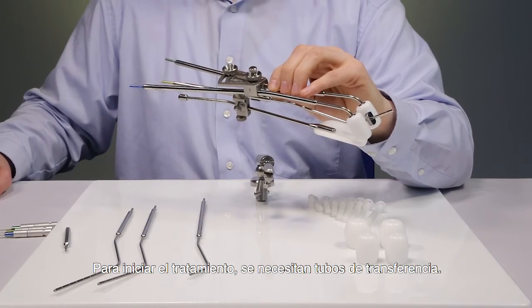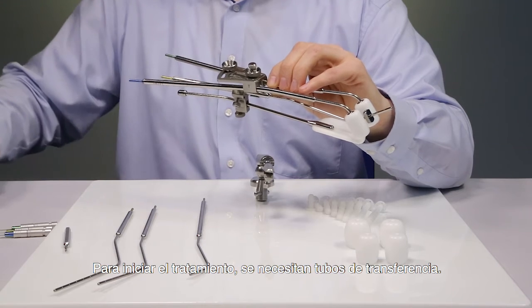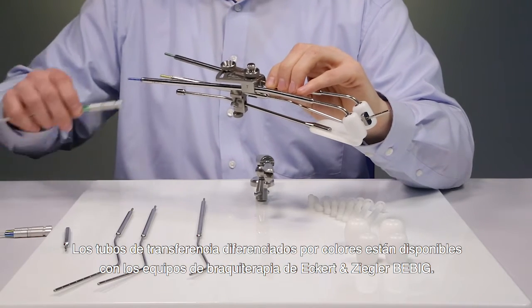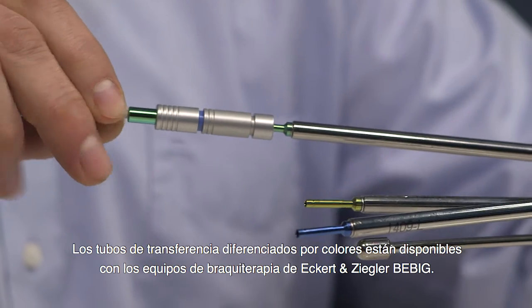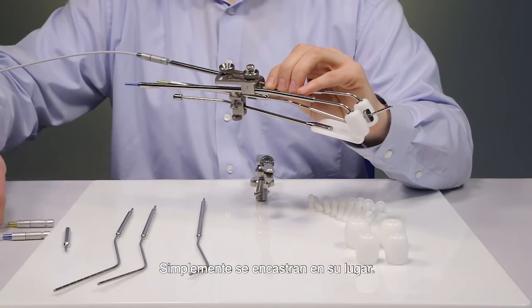In order to start the treatment, transfer tubes are needed. Color coded transfer tubes are available with Eckert & Ziegler-Bebig afterloaders. They are simply clicked into place.